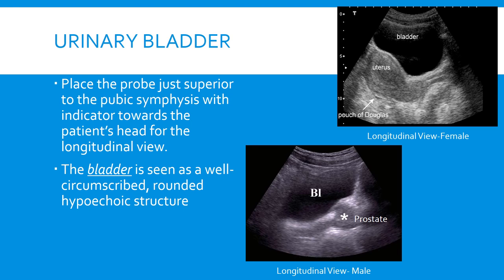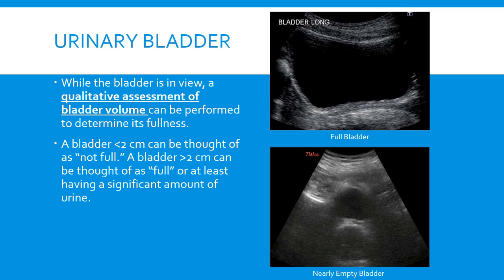To find the bladder, we place the probe just superior to the pubic symphysis with the indicator pointing towards the patient's head, giving us a longitudinal view. The bladder is seen as a well-circumscribed, rounded hypoechoic structure. You'll see the difference between male and female views in the pictures on the right — in a female you'll see the uterus just posterior to the bladder, and in a male you'll see the prostate just posterior to the bladder. We can do a qualitative assessment of bladder volume: less than two centimeters indicates not full, and greater than two centimeters indicates the bladder is full or has a significant amount of urine.